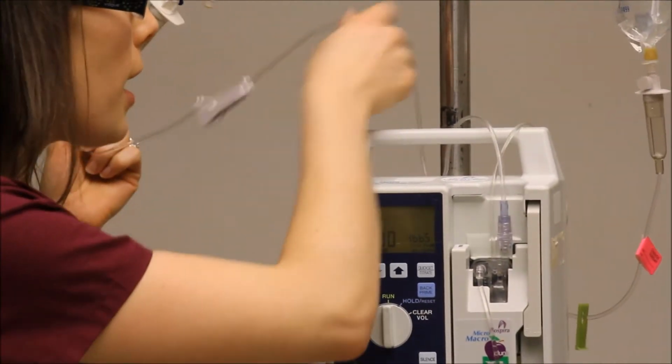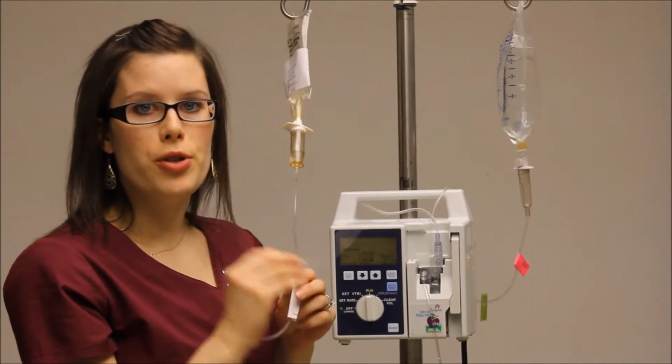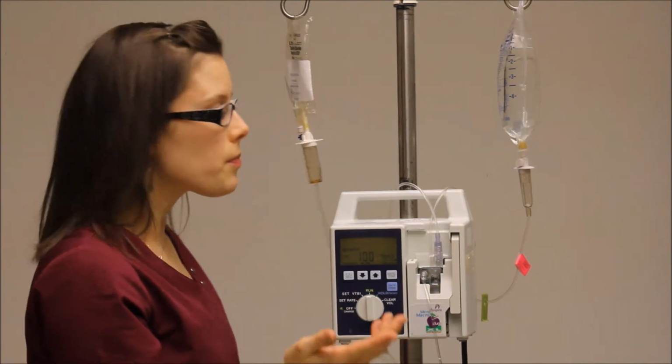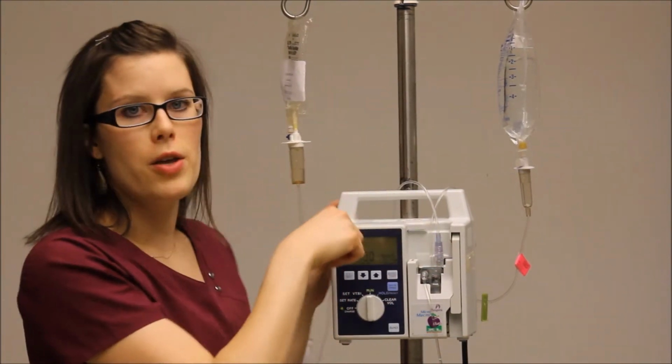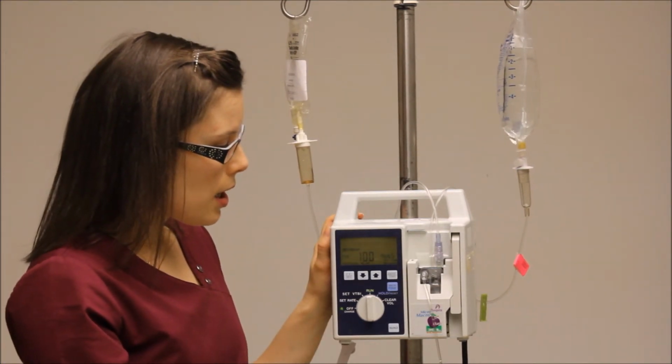Now one other thing to remember, I didn't show you guys, I had already done this prior to, but make sure that you prime your tubing because otherwise you're going to start infusing air and the pump will alarm for that. So prime your tubing and then you would connect it. So now you can see that it's running and you're good to go.